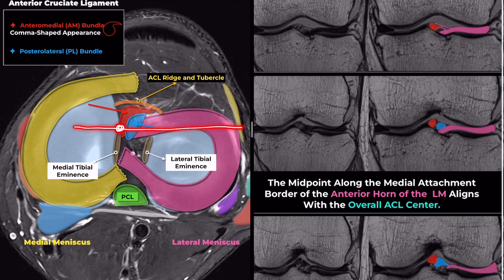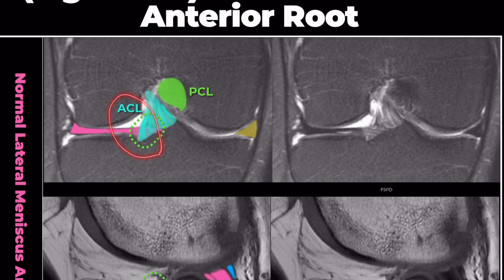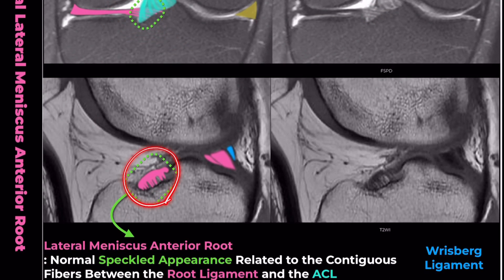Therefore, from medial to lateral, the anteromedial bundle, posterolateral bundle, and anterior horn of the lateral meniscus become visible. The anterior root of the lateral meniscus consists of three or more multiple fiber bundles and is fan-shaped. This fissured appearance on MRI is due to fibrofatty tissue interposed between the insertional collagenous fibers of the anterior root and interposed fibers of the ACL insertion.